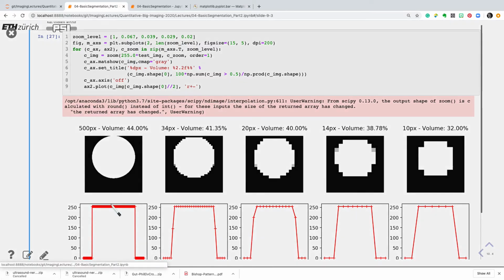And you can see in this area here, there is a gray pixel, and that is a partial volume effect from the downsampling. Same you can see on this one, and that actually also corresponds to this value. It's a little bit brighter, so you can see it's also higher up. This one is pretty dark. Also here you have some, and on the last one, well, there nothing appeared, but it could also possibly happen.